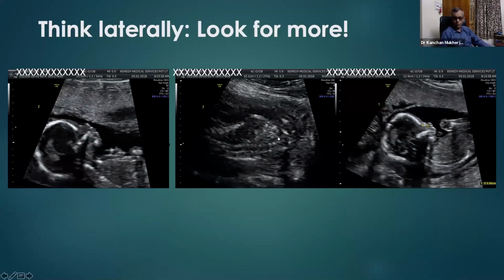When we did amniocentesis, this one was Down's, this one was normal, and then we did a selective feticide. Basically, if you stopped at just absent nasal bone and nothing else, and didn't guide the clinician about amniocentesis, this would have been missed because it was already 17 weeks by the time she had these findings detected.